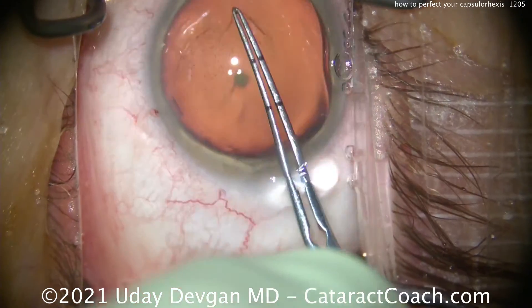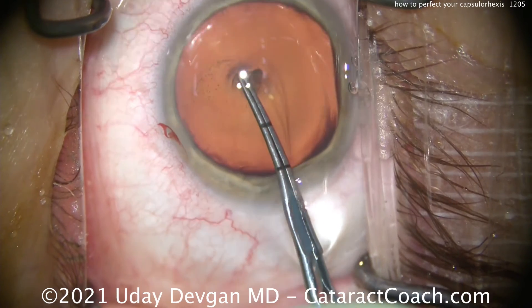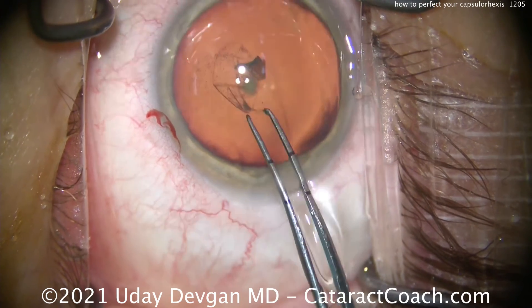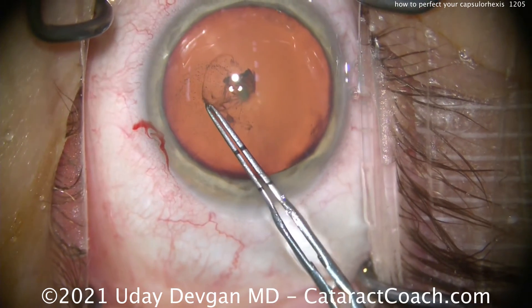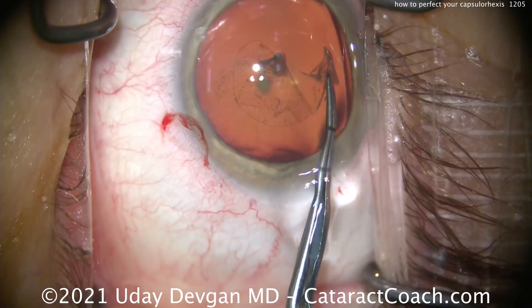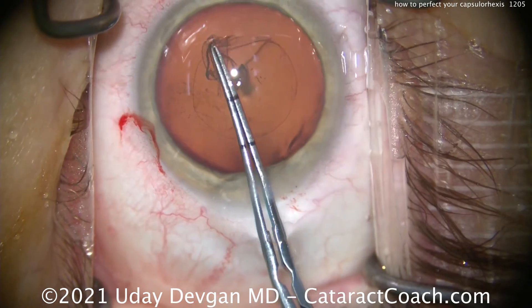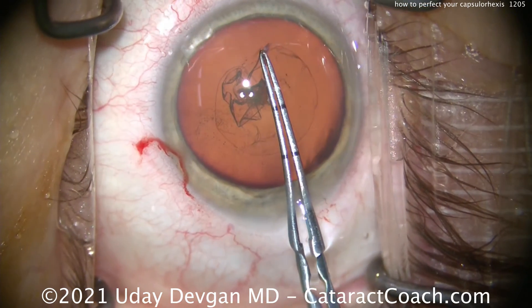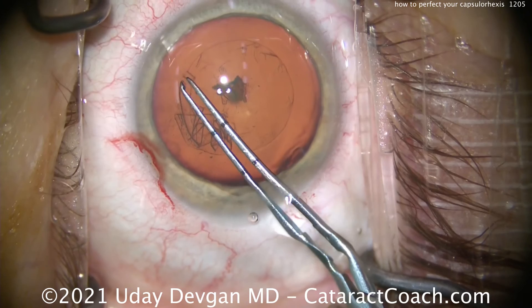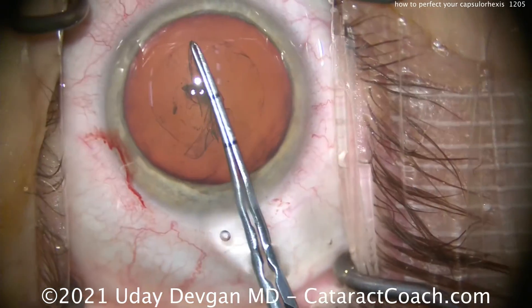Let's show you one more time, going back to the first case. Poking in the center — this is again a capsule that has a little bit of laxity to it. We poke in, start the rexis; it starts off smaller than we desire and that's okay. Here's where I spiral it out — I measure again, getting a good mental idea of what I want. Spiraling it out, now that I have the desired size I'll continue that curve. Notice all the pivoting — the trick is the pivoting; with the pivoting you can create the better rexis. And now don't pull centrally but rather — say it with me — continue the curve. Grab that little edge and continue it, and that looks beautiful.